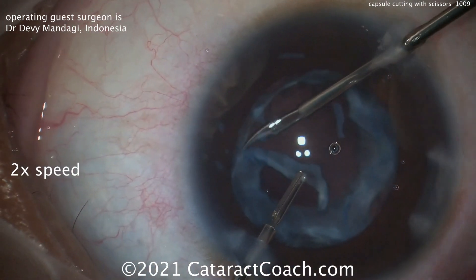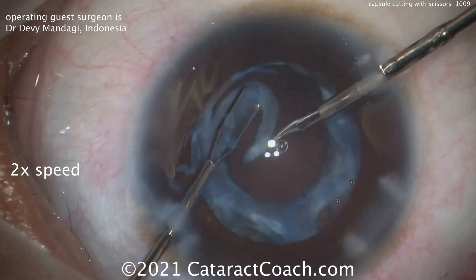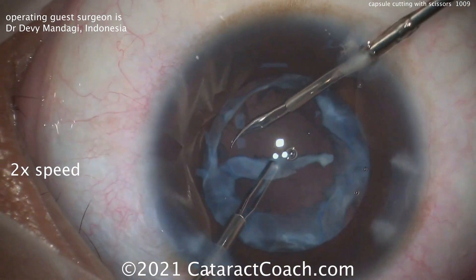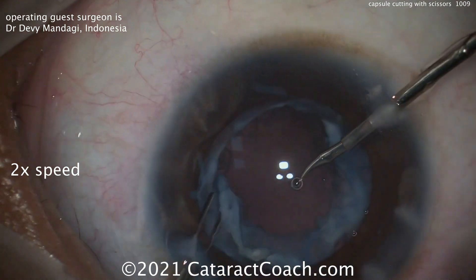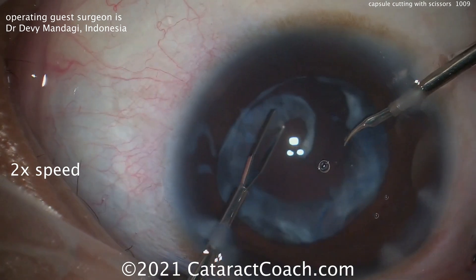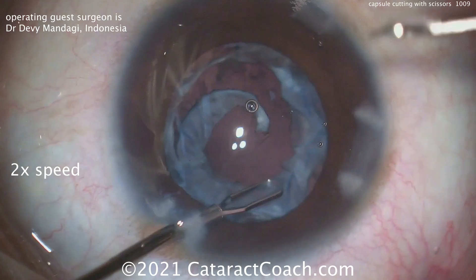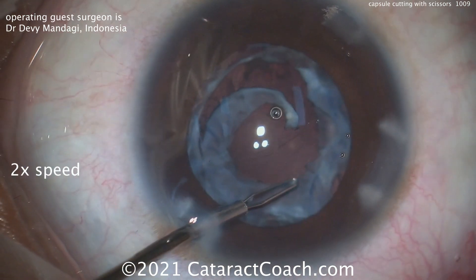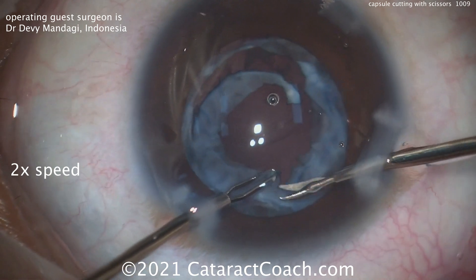The goal is to make a normal-size capsulorhexis or capsulotomy of about a five millimeter diameter — that'll give great long-term results for the patient. If you leave the big white fibrotic ring there, it minimizes the patient's effective pupil size and may also be visible. If the patient is indoors and the pupil dilates beyond that white rim, it may look quite odd. So you should go inside and finish cutting it to a normal size.